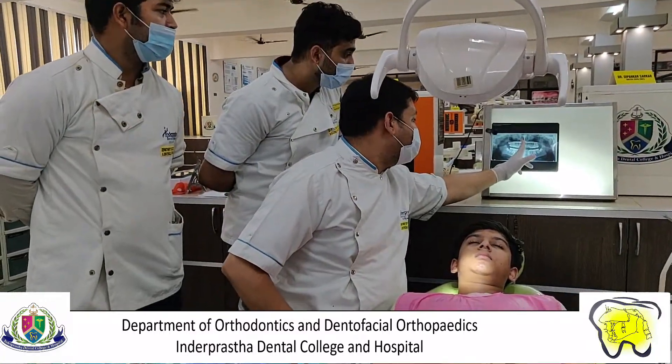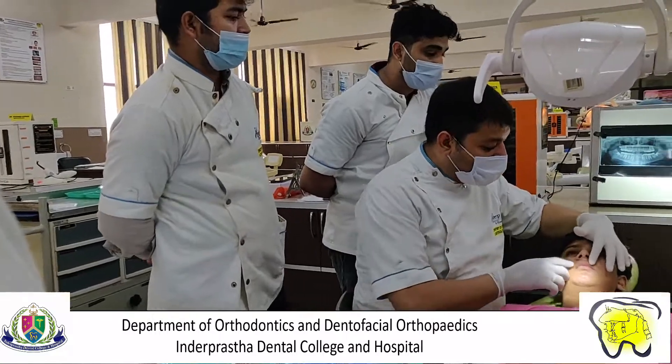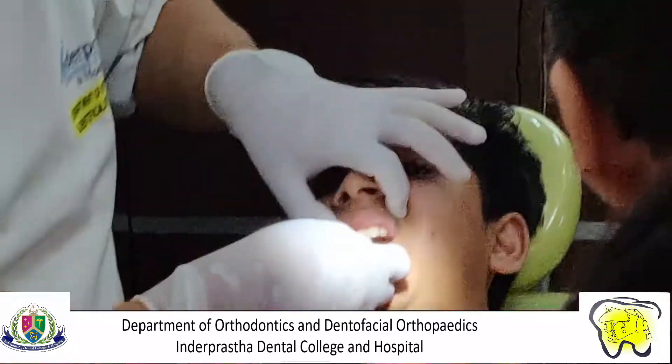A proper alignment of crowns and roots is ensured by proper bracket placement, which should be equidistant from all four aspects of the crown and is placed according to the angulation of roots. This is done with the positioning jig and positioning gauge.